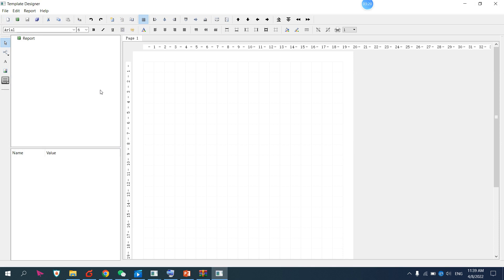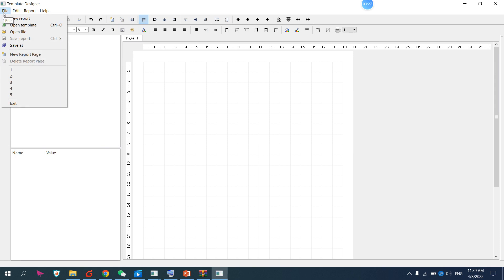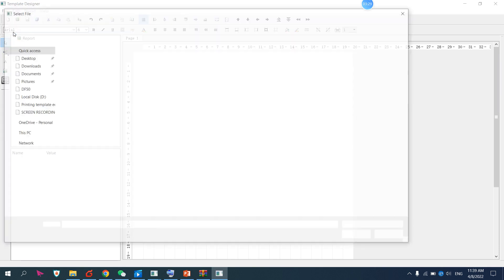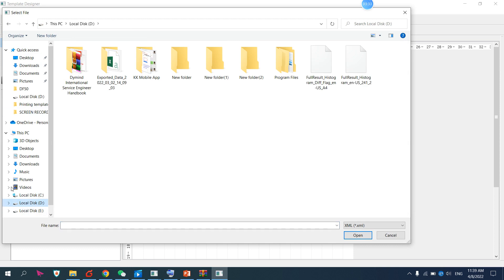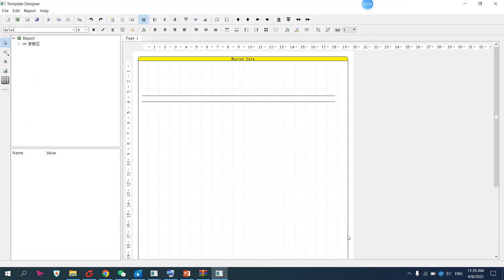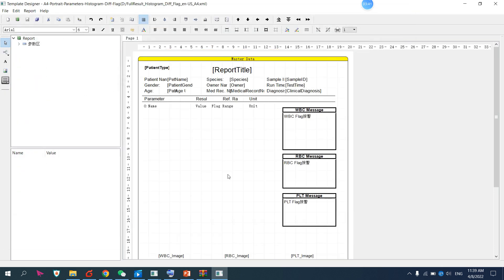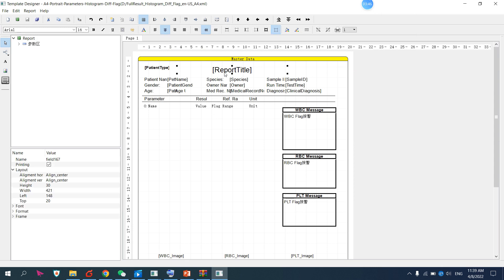When you open the software, you should already have the USB connected to the PC. Then go to Open File. I already exported my file to the D drive, so I go to D drive, find the file, and open it. Then if you want to edit, you can edit — for example, this element here.